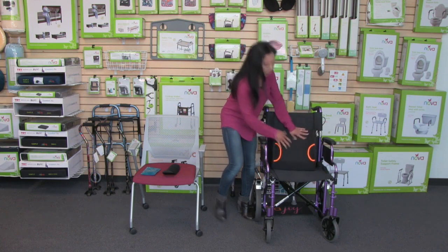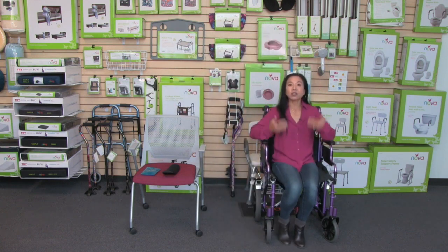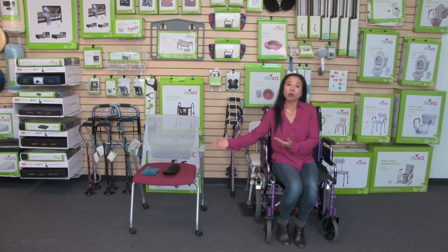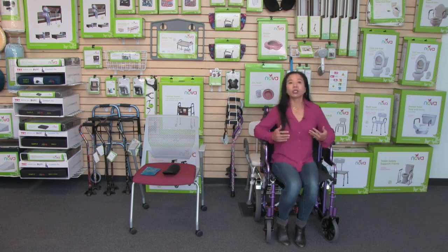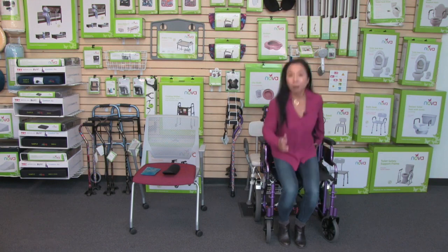Having a lumbar cushion is so comfortable on your back. For any seating surface — a wheelchair, transport chair, or a chair — it really supports your lower back and keeps your spine in proper alignment and good posture.